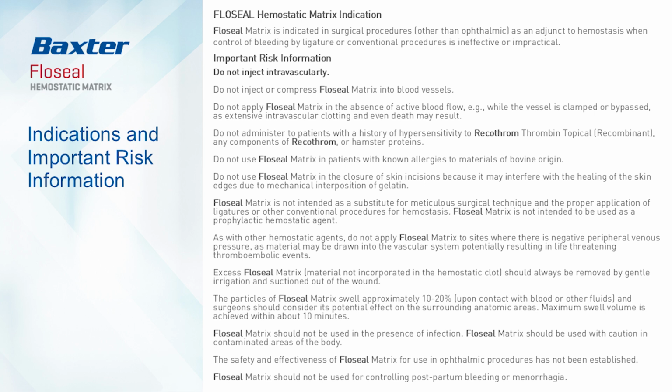Excess FLOSEAL matrix, material not incorporated in the hemostatic clot, should always be removed by gentle irrigation and suctioned out of the wound. The particles of FLOSEAL matrix swell approximately 10 to 20% upon contact with blood or other fluids, and surgeons should consider its potential effect on the surrounding anatomic areas. Maximum swell volume is achieved within about 10 minutes.